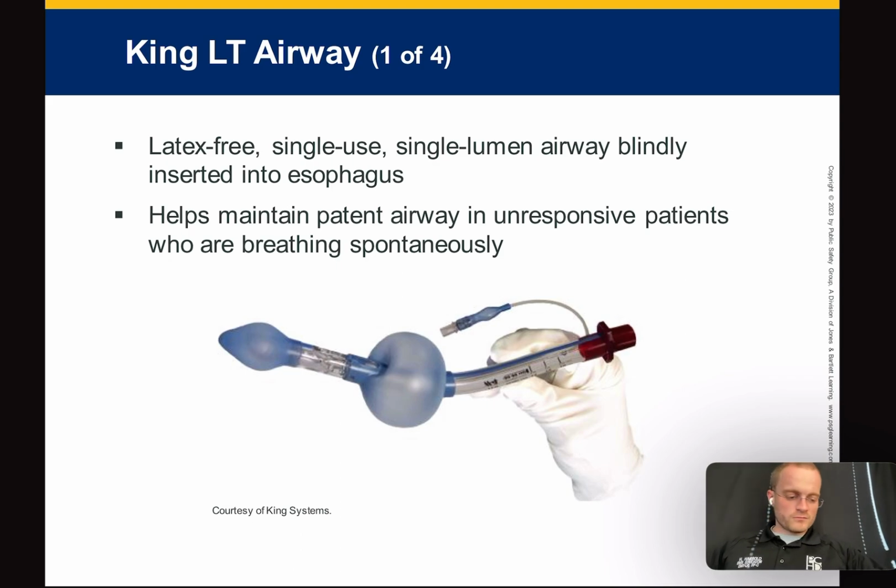Right here. Okay, you attach the BVM, the bag valve mask. And how do you do that? You remove the mask, and this adapter right here will perfectly fit this adapter right here. Okay? They'll accept each other and make a bond.